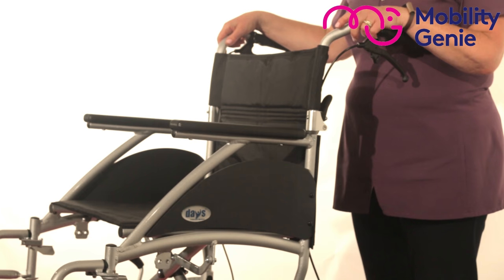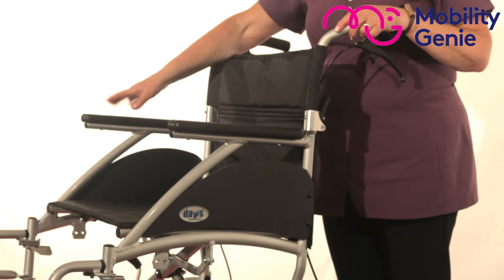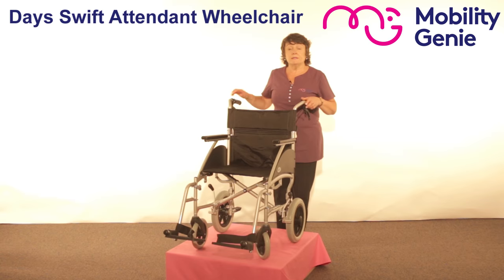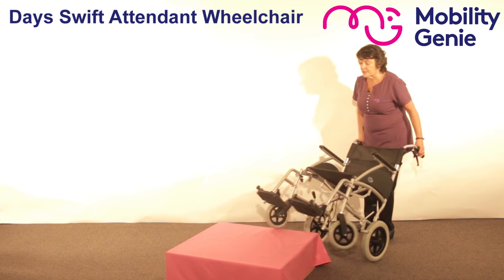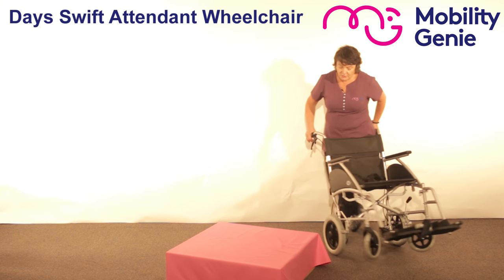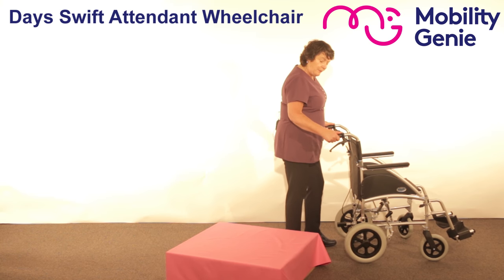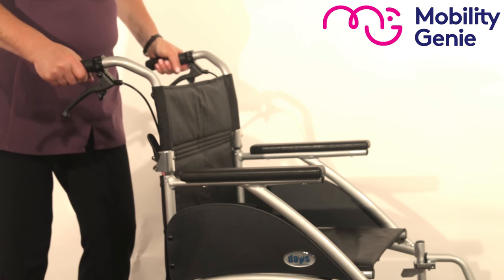It's got a lightweight aluminium frame and the seat and back are padded with padded fixed armrests. Now just to show you a few more features, I'm going to turn it around. Your hand grips are very comfortable to use.